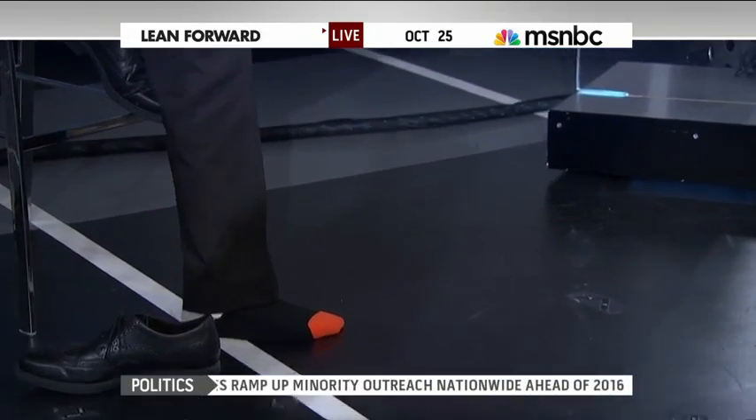How much does it cost? At the moment it costs between $20 to $25 to make, and I'm planning to commercialize it soon and make it very affordable.